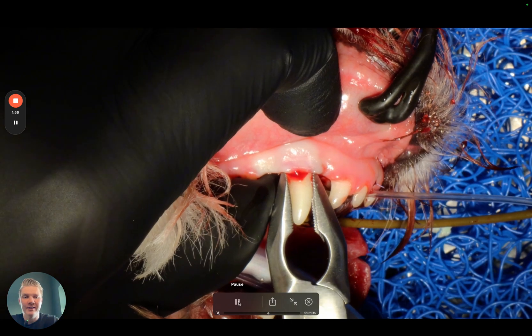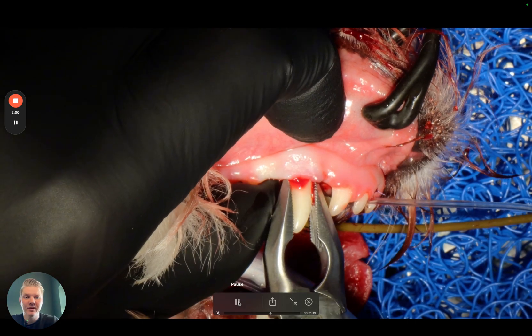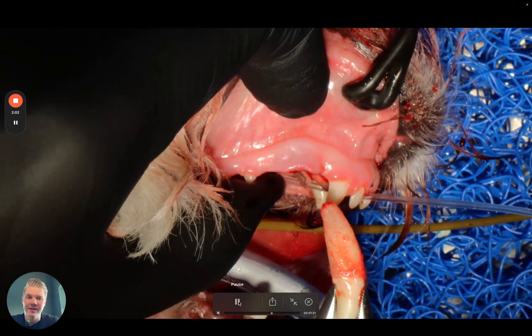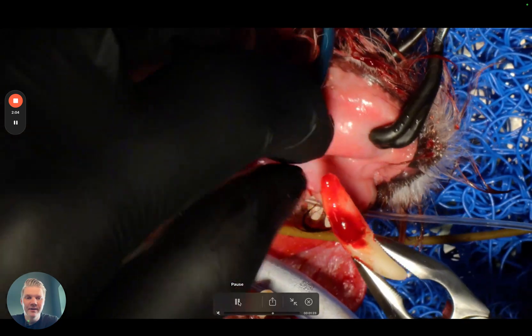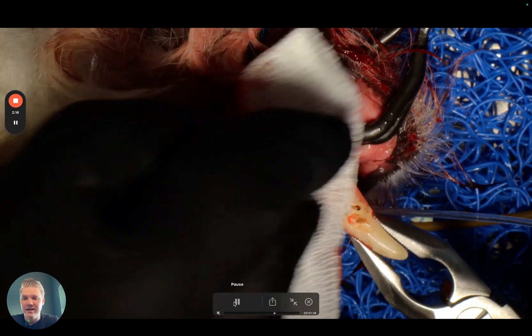You can twist quite hard and you see here that it is finally getting loose and coming out — just one second, here you go. So look at the grip here, how nicely this forceps adapts to that tooth surface. This is crucial for getting those canines out.